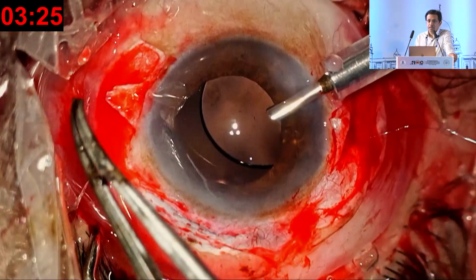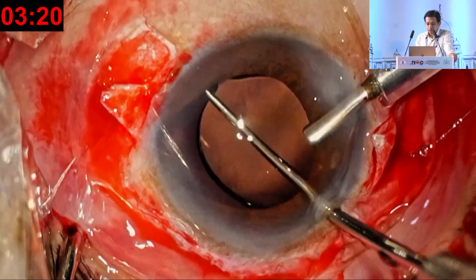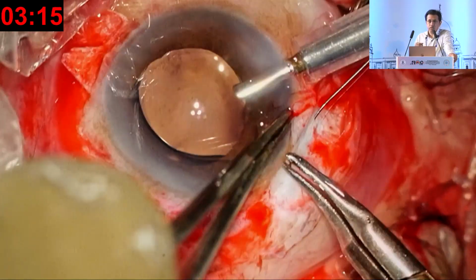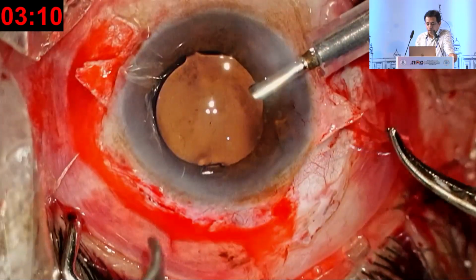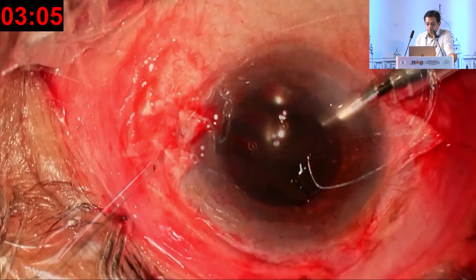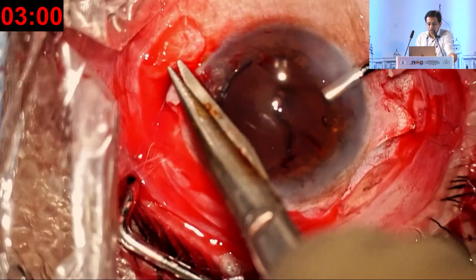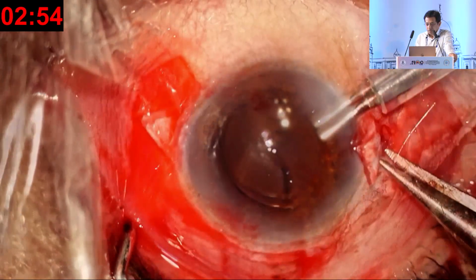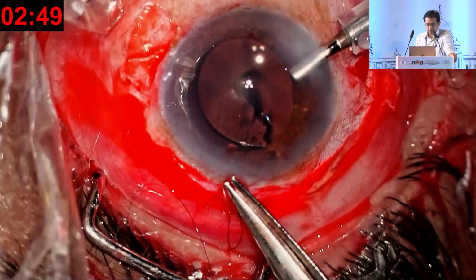And this is a critical step where you are going to ensure that the lens is reasonably centered. Both the sutures are externalized, and now we're going to use the same needle to suture it to the scleral bed so that it fixates well. You're going to use 3-1-1 knots, which are then sutured on either side. And before tightening, we ensure that the lens is well centered so that the traction is equal on either side. Then you cut the knots, and then the wound is closed. Until the last moment, you keep the AC maintainer, the fluid, running inside.